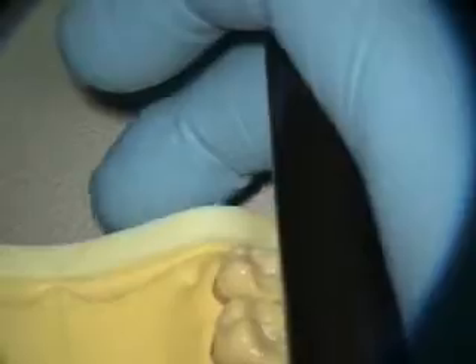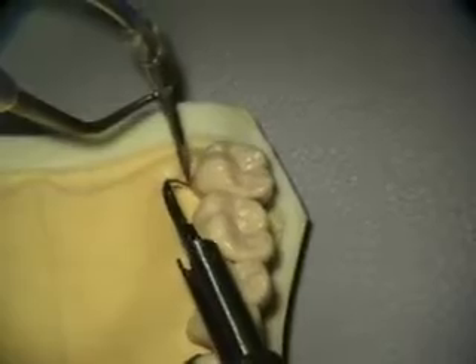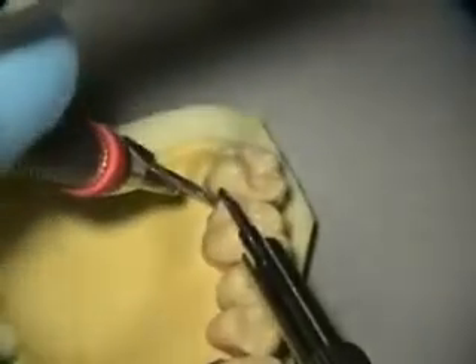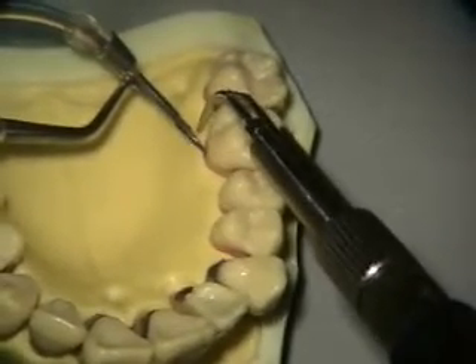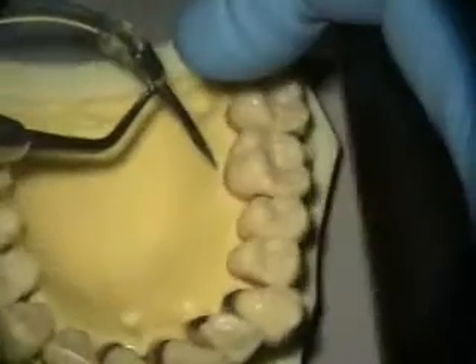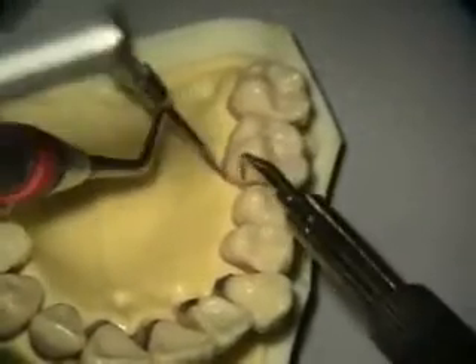Our patient is positioned and I go to the distal palatal and look back in there, then come around to the mesial. Sometimes you have to point it down into the furcation and clean the furcation. Moving to the distal palatal — sometimes you have palatal pocketing. If you get a little too toward the horizontal, the water's not going to pull, so your view will be better when you angle up because the water pulls more. It pulls real easily in pocketing.